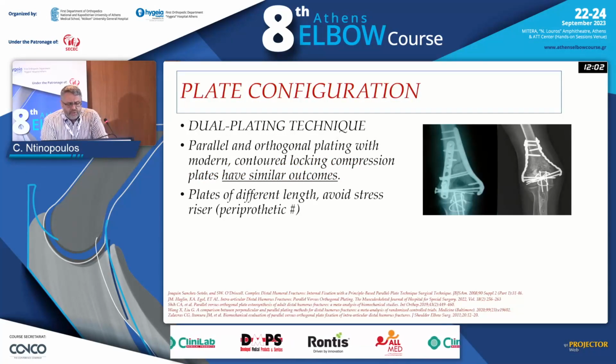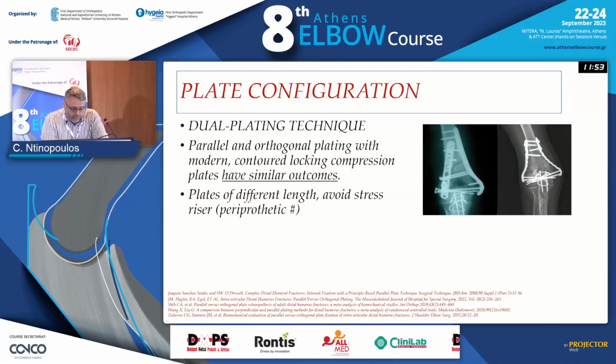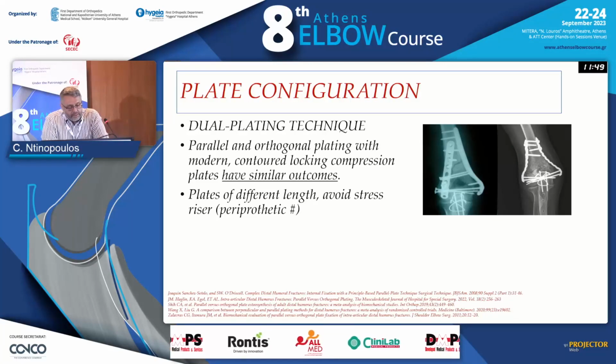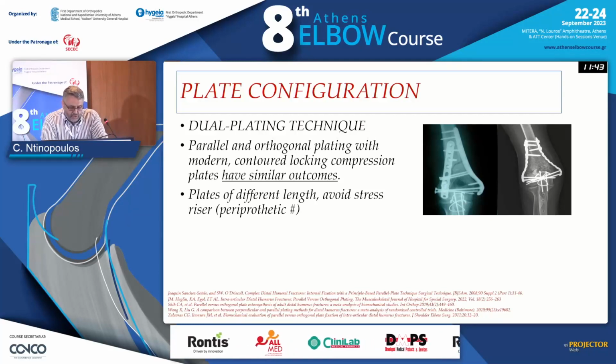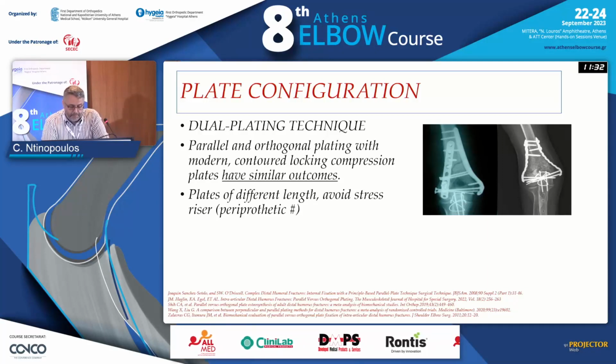Plate configuration. Usually it's a double plate technique. There are rare occasions that a third plate can be put. The original work of O'Driscoll suggested parallel plates, but parallel and orthogonal plating have similar outcomes in the literature. An advice would be to put different lengths of plating, so you would avoid the stress riser and possible periprosthetic fracture.